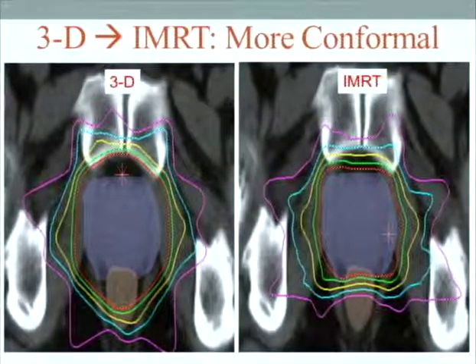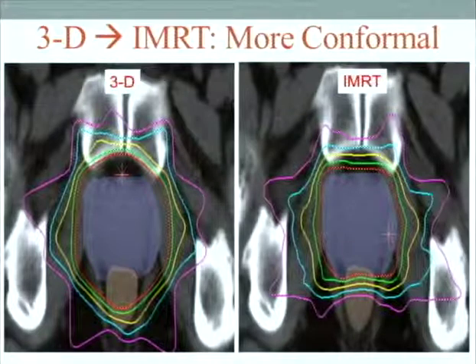This all looks well and good, but the CT plan is a snapshot of the prostate in time. The prostate tends to move. So between each fraction, there can be a significant amount of movement of the prostate, superiorly, inferiorly, anteriorly, and posteriorly.